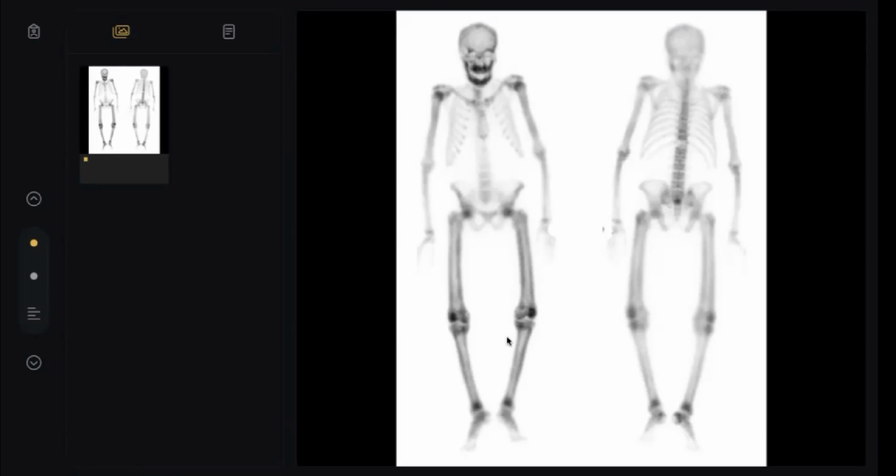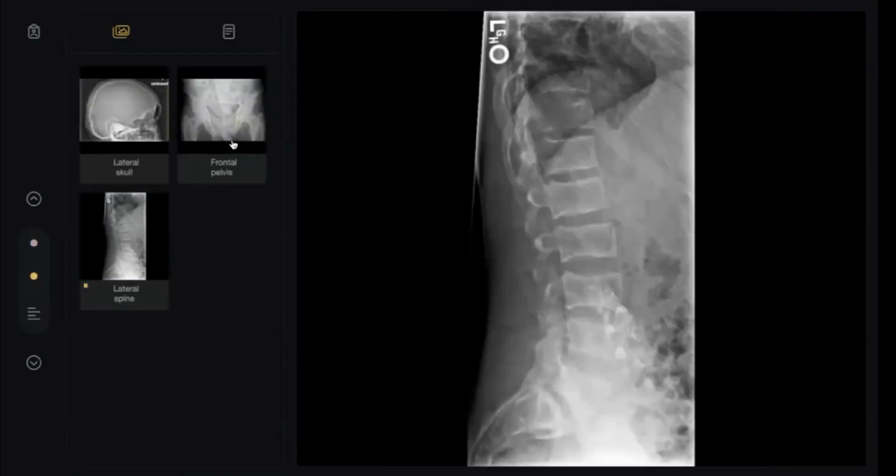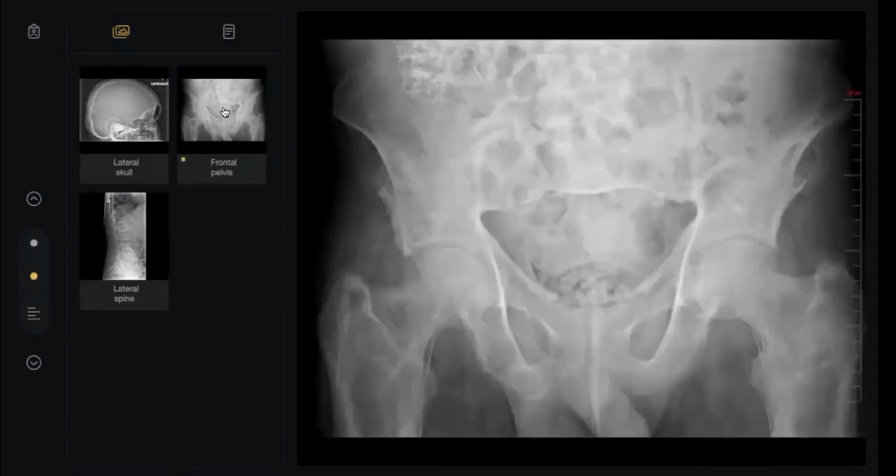By the way, hypertrophic pulmonary osteoarthropathy is not a metabolic disease. Metabolic means metabolism, either enzymes or hormones, a big difference. So, I will show you this. What happened here? What is this?